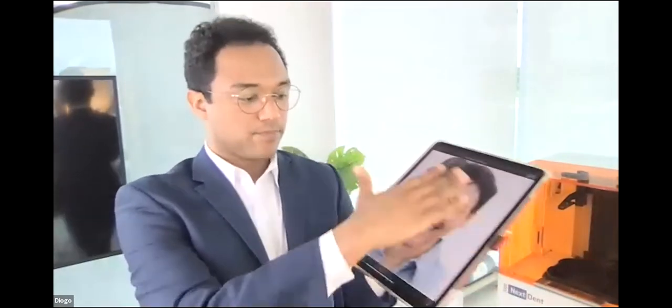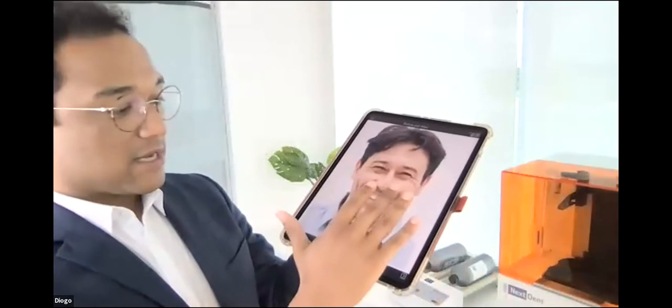Of course, along with smile design, as this is a motivational design, it's an educational design, you get a lot of information for yourself as well. Because as you are designing, you can select different teeth sets on this design and you can show your patient different case scenarios, different treatment options using the same photo with the same design. So you can change the height, the proportions, the shape. And then you also learn more about what your patient is looking for in a smile makeover.